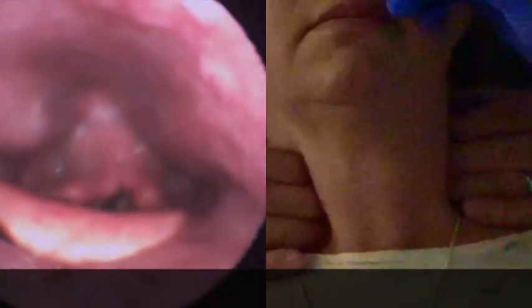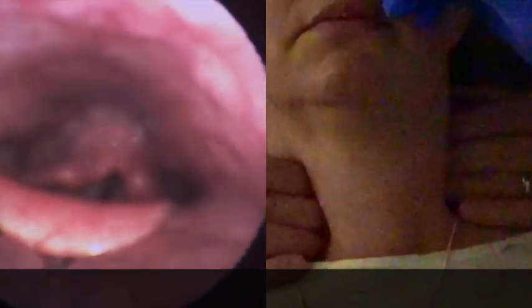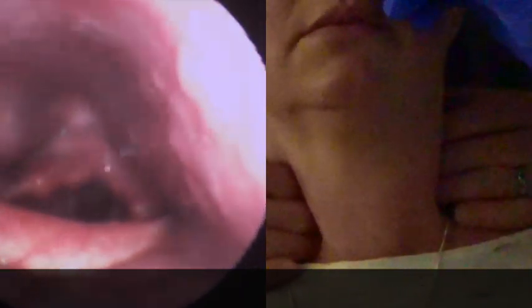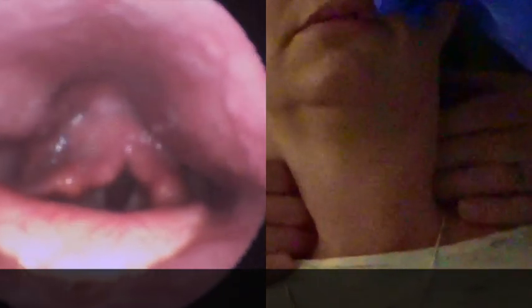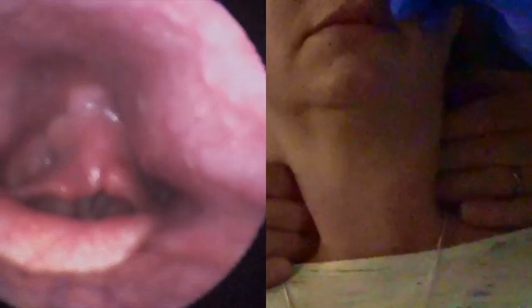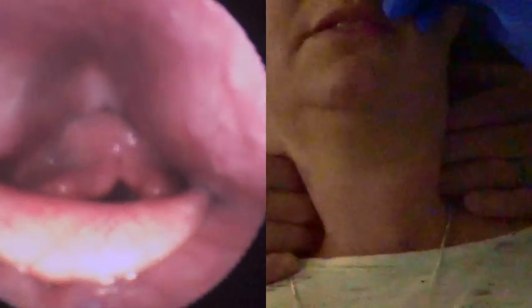Can you say that a little louder? I've noticed here that just in these few minutes, she seems to have more maneuverability, so I'm having to do more micro adjustments to keep an image for you guys. It's just an interesting observation. I'm still looking for things that feel like crud pockets to me. I'm still looking for that stuff, and I don't want you to discourage yourself from doing that. Be nosy, be curious.